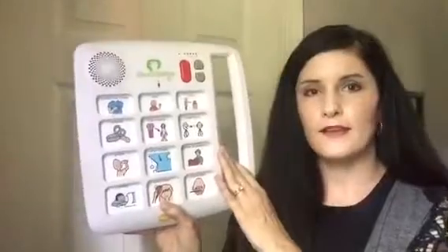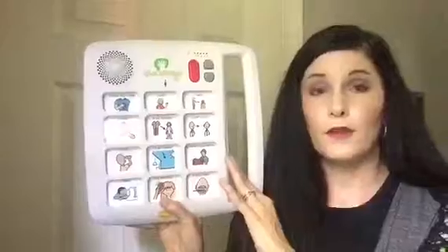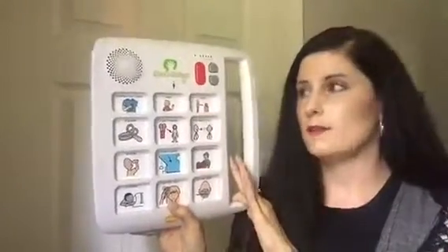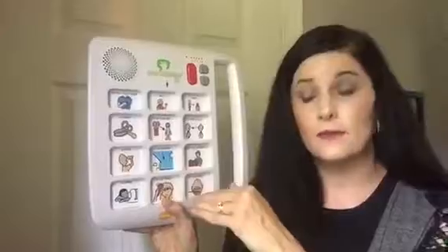Now I would say the only downside to this was the fact that you had to slip this in and out, and the other ones were in the back, and it was a little bit cumbersome to have to switch those pages in and out. So this was great, and we were very grateful for it, but it probably didn't last as long as we would have liked because it was not very easy to switch in and out. But again, it was still the same concept that we had started with when she was 2 years of age, using the pictures to communicate.